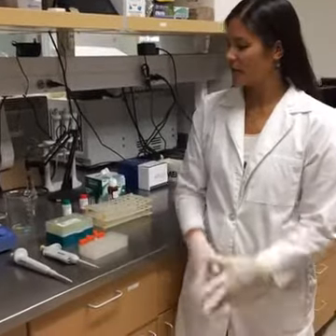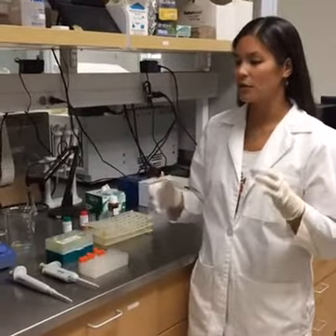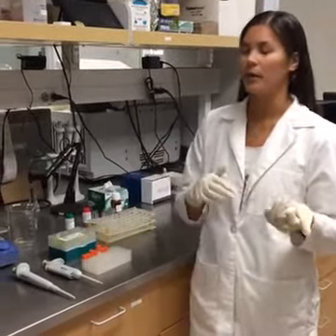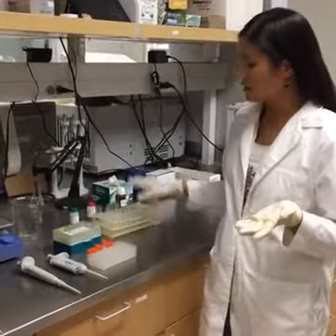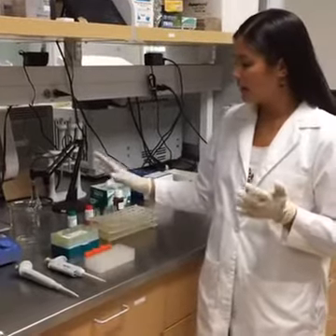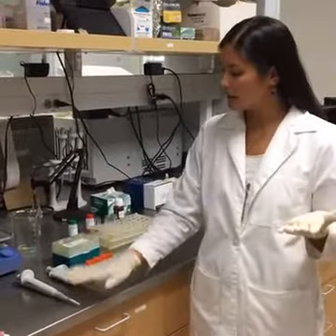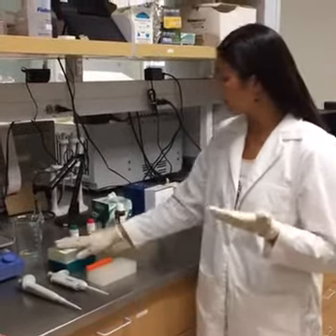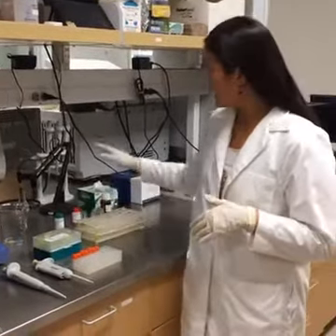Sure. So this is a setup for one of the radioimmunoassays that I was using to analyze the sea otter blood samples for things like stress hormones like cortisol or corticosterone. I've got my blood samples, and we're using pretty typical laboratory equipment like pipettes, pipette tips, and tubes that our reactions actually happen in.